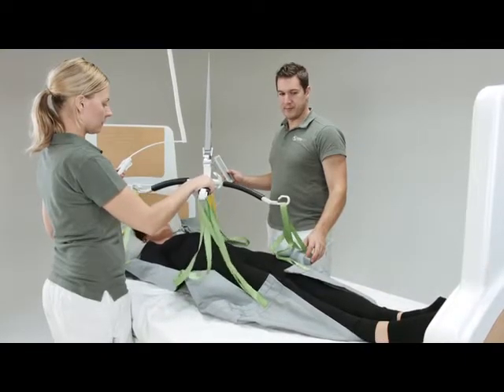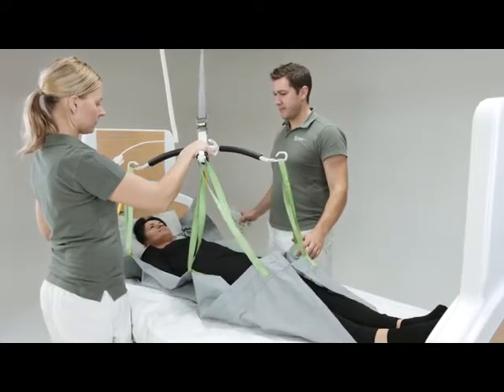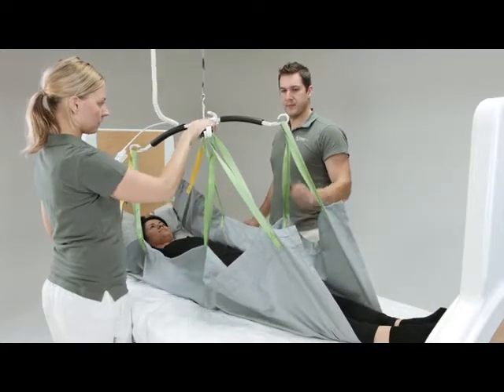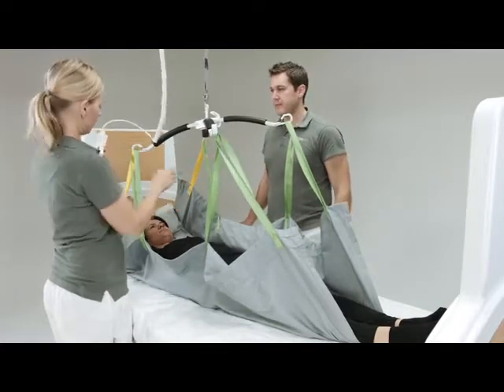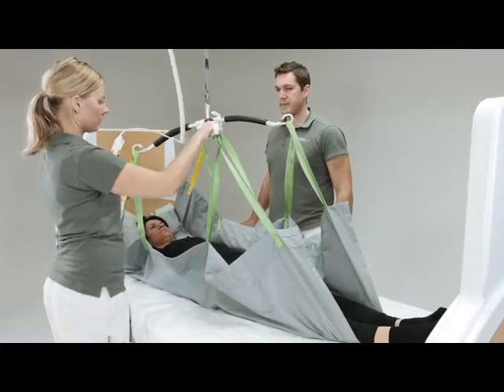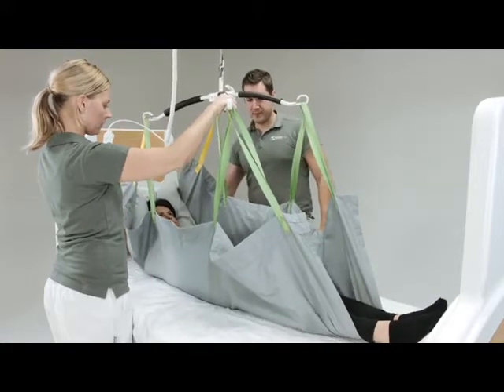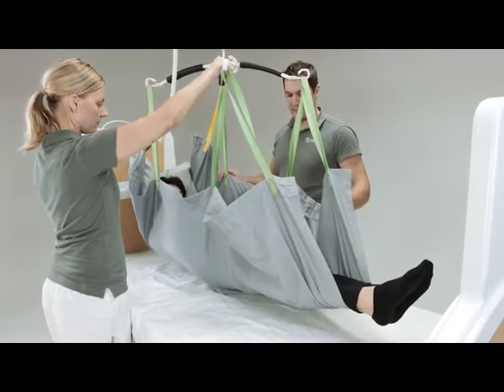Hold the lift away from the patient's face with one hand as you raise it above the patient's head. As you begin to lift, pause when straps tighten to check that all the lifting straps are securely attached to the hooks. Continue lifting the patient. It is recommended to always maintain one hand on the patient during movement for safety.